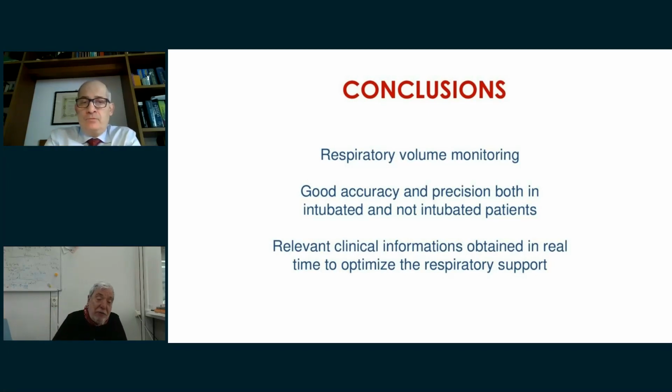But I know a lot of people say, well, we do not measure esophageal pressure because it's more work, and many do not know how to use it. But if you have the esophageal pressure together with the mechanical ventilation, the tidal volume, and respiratory rate, you may compute the summary variables, the mechanical power ratio. So you have a complete monitoring of the state of your patients.